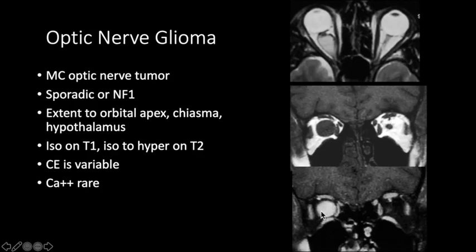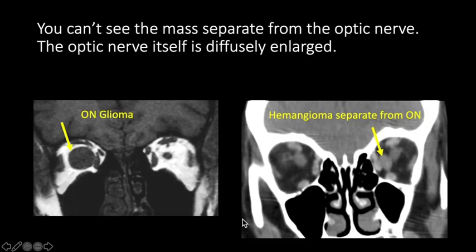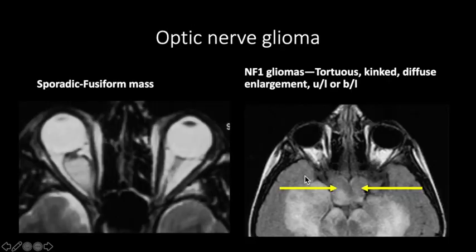Optic nerve glioma arises from the optic nerve, so you will not see the optic nerve separate from the mass — in contrast to other intraconal masses like hemangiomas where the mass is separate from the nerve. When sporadic, it presents as a fusiform mass lesion. When part of NF1, there is diffuse enlargement of the optic nerves and they will be tortuous, kinked, or buckled. It can be unilateral or bilateral, but bilateral optic nerve gliomas are pathognomonic for NF1. Here we see a mass involving both optic nerves and the chiasma.